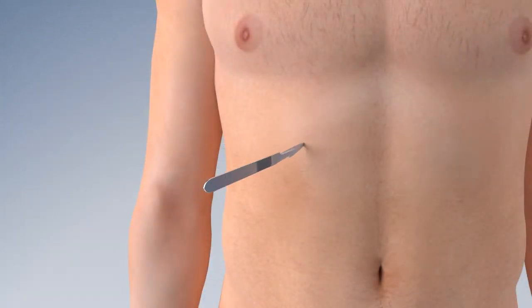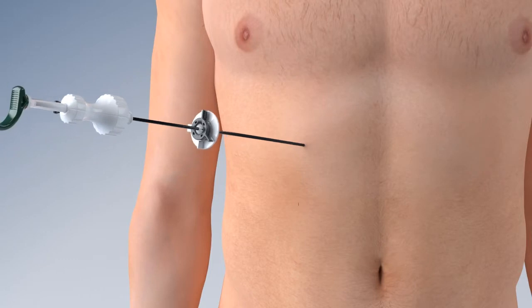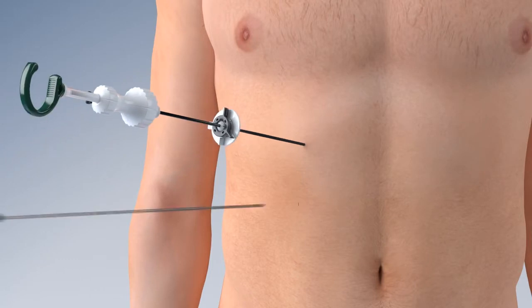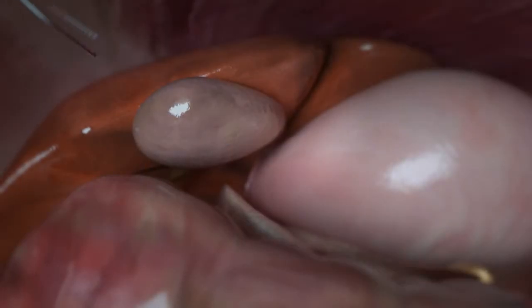First, make a small incision with an 11 blade scalpel. The Minilap device is percutaneously inserted without a trocar into the abdomen with its integrated needle tip. The device is then deployed to grasp or coagulate tissue.